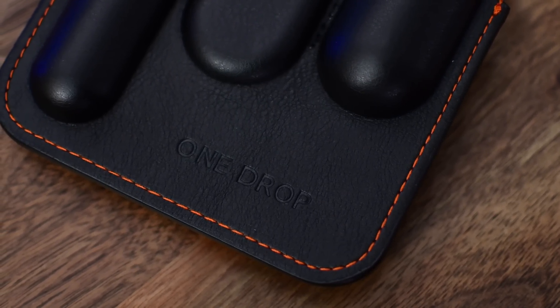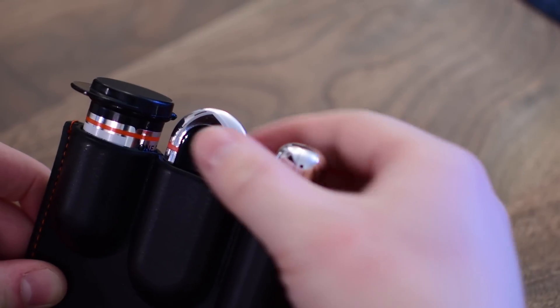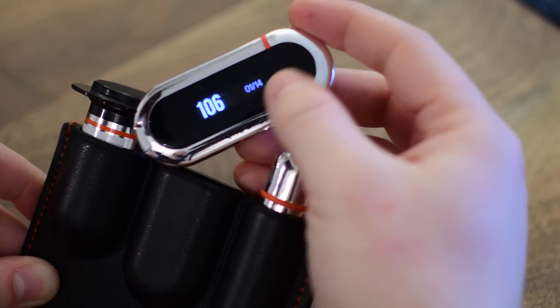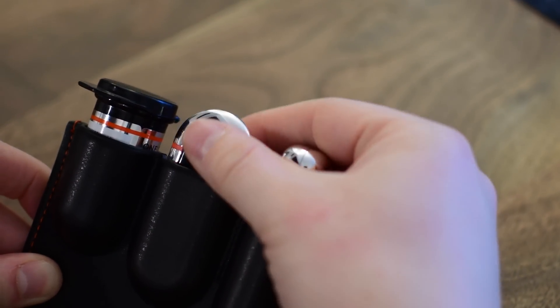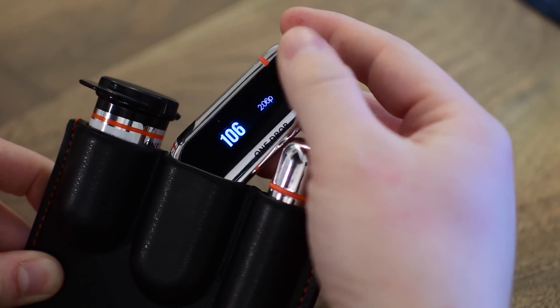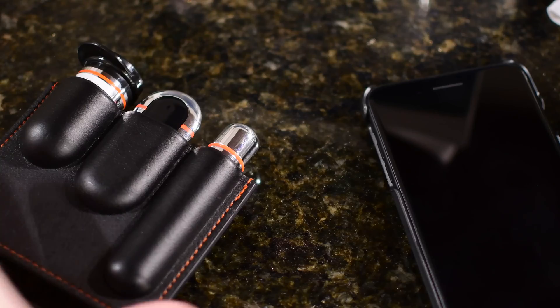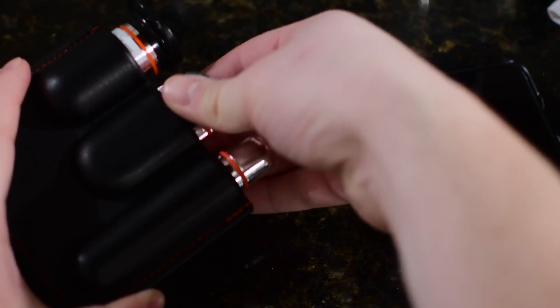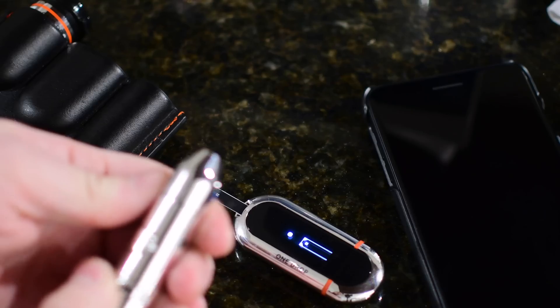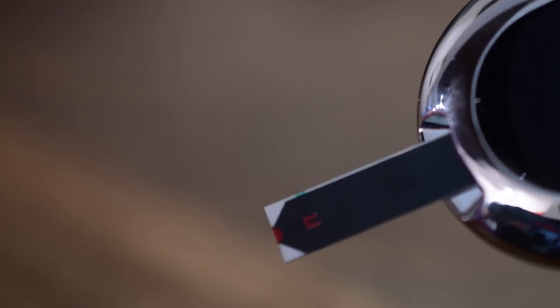One minor complaint I had was when you're actually taking the meter itself out of the case. If you put it in correctly, it has the accent side up, but that's also the side with the button. So as I'm trying to pull it out, I'm actually pressing the button and turning it on without meaning to. It's a pretty minor problem — if it bothers me that much, I can just turn it the other way. When you do use it over time, they become easier to take out of the case, to the point where they'd almost fall out if you're not paying attention.